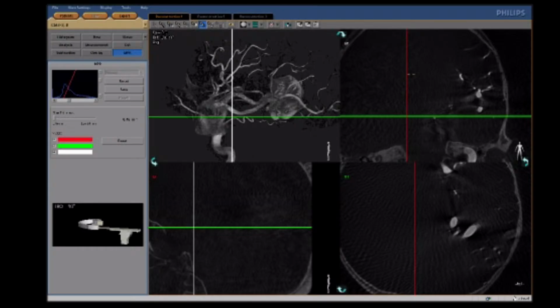Okay. We asked Zoya to give a Sonic 1.5 25, which is without the hybrid inside the box. I don't know why the company started to produce the Sonic without wire. And now the treatment became a little bit expensive because we need to buy the wire separately.